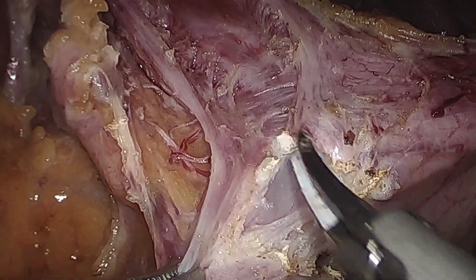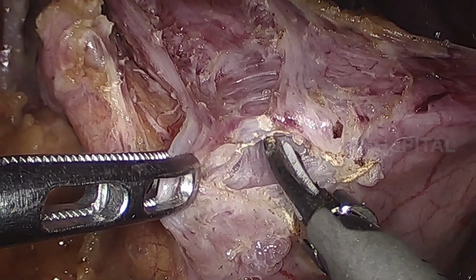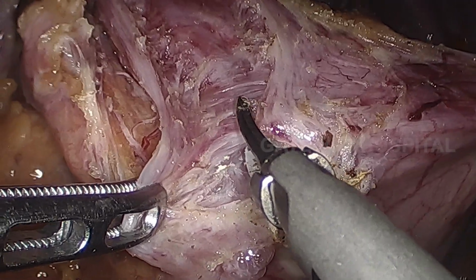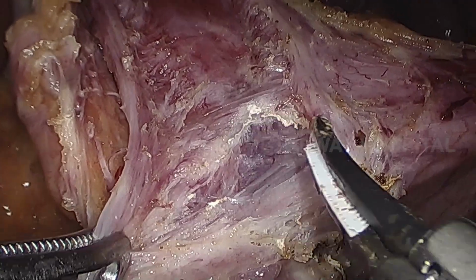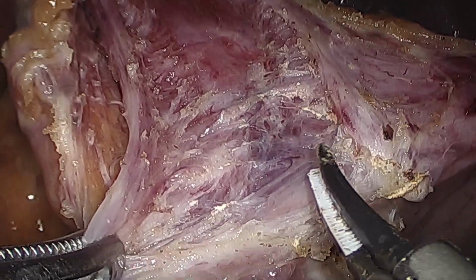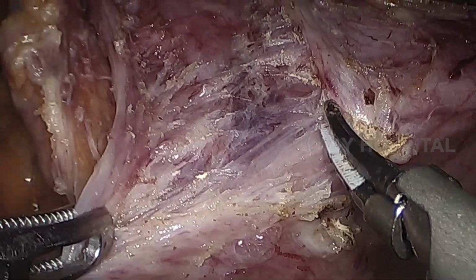Here we will have one more layer, that is the oblique muscle fiber of the stomach, that needs to be divided. Once you reach the submucosal plane, you can appreciate the appearance of the submucosal vessels very nicely. You can appreciate here the submucosal blood vessels are coming into view. That means you have entered into the proper plane.